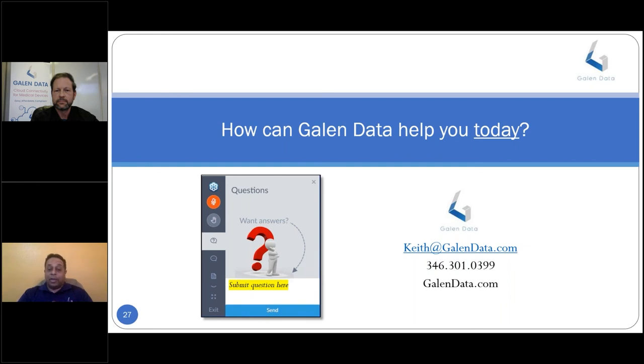At that point, if you're going to have other vendors have access to your data, like for example, if you build on top of us, we have access to your data, you need to make sure that there are agreements in place. So the responsibilities you have are transferred to all those vendors. And in HIPAA's terms, it's called a business associate agreement. Everybody becomes a business associate to you and it has an agreement that outlines, again, the same things: what data has been collected, what it can be used for, and what the responsibilities are for that.